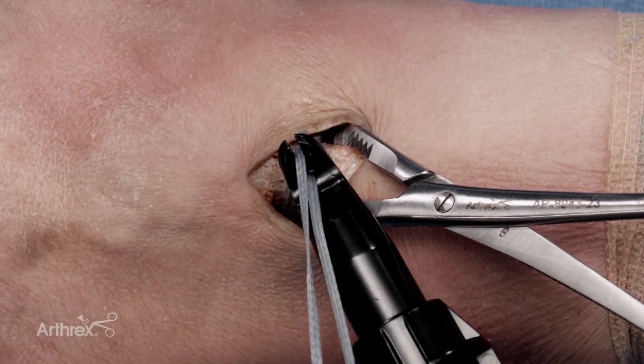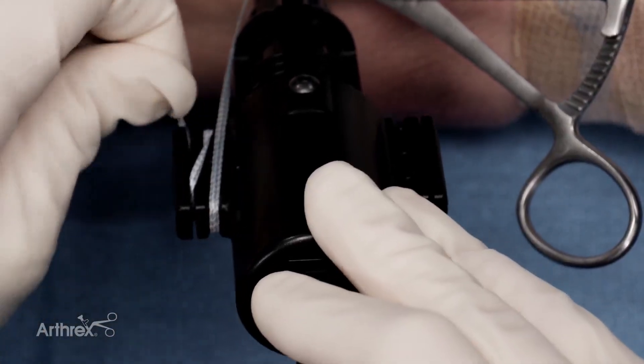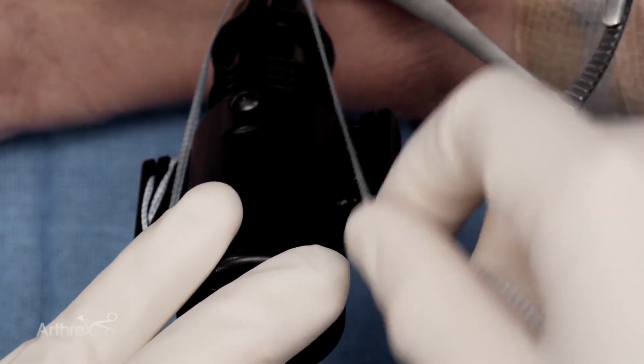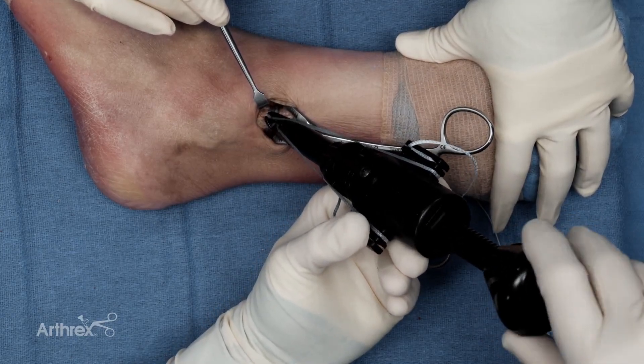One tail goes through the hole in the disposable tensioner and the other portion goes into the slot at the end of the tensioner. I'm now going to load the tensioner — one limb goes around the left side and is cleated, and then the other limb goes around the right side and is cleated. The tensioner is then placed collinear with the knot, directly on the knot, and tensioned.